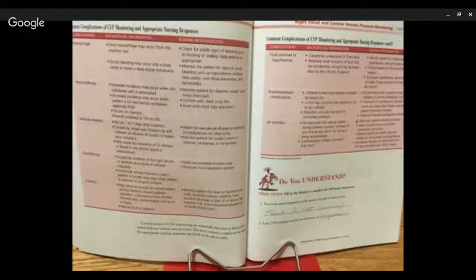And to prevent hypothermia, administer warm IV fluids if large amounts of fluid are to be infused. Thromboembolisms from a CVP. Catheter lumen may become occluded by a blood clot. A clot may surround one segment or all of the catheter. Migration of a clot may result in pulmonary embolus, which is deadly.